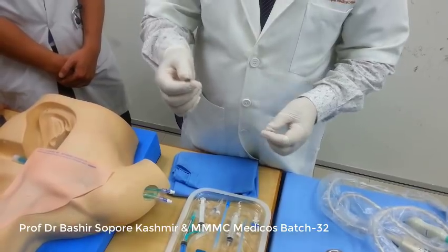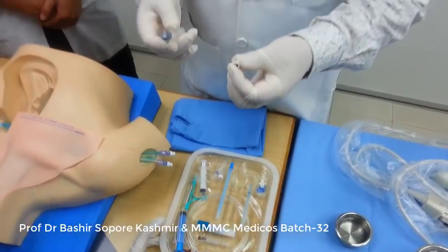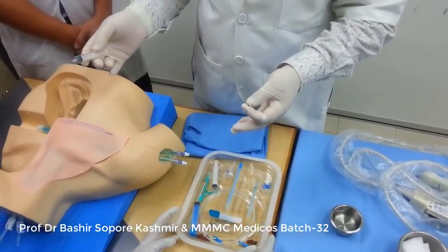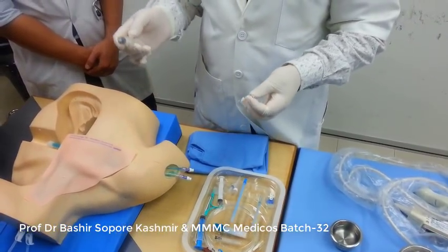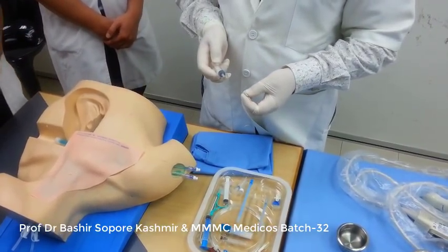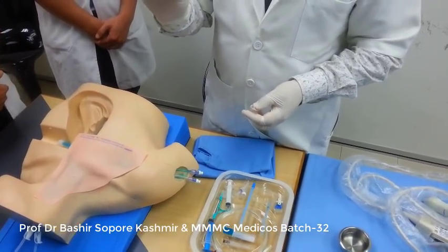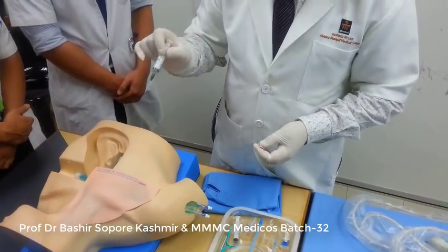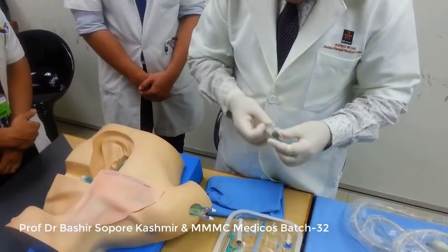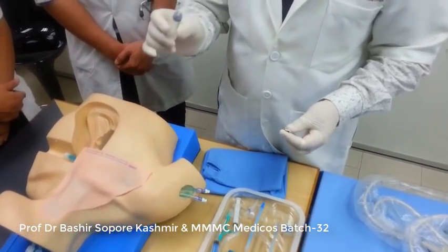Because through this needle we will give local anesthesia, so that the patient gets as little pain as possible. It is attached with a 3 ml syringe, and 1% lidocaine is given through this needle, maybe around 3 ml.